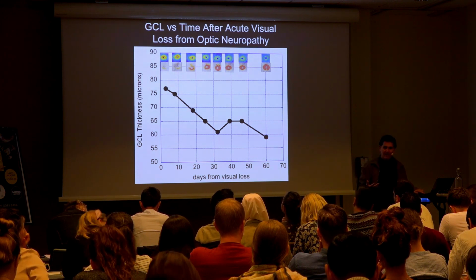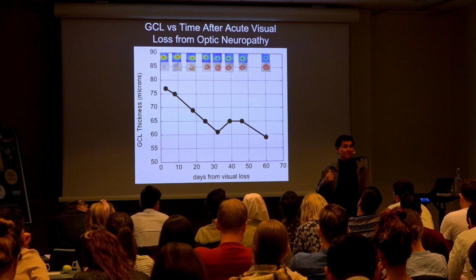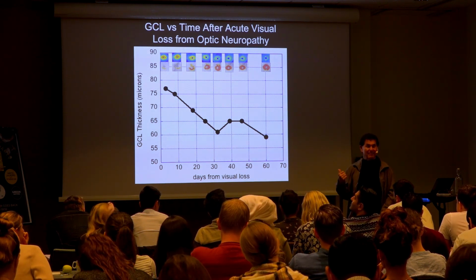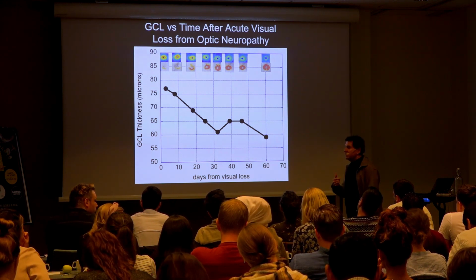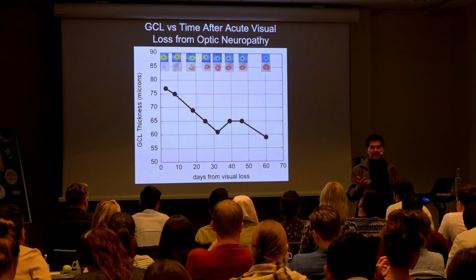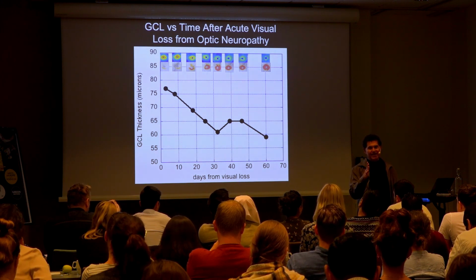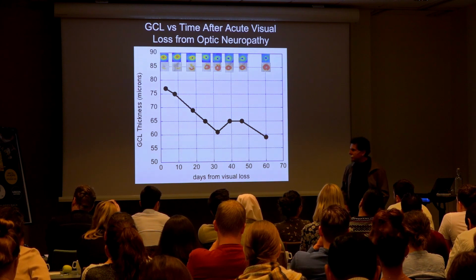And how does the optic disc look? Remember, there was some atrophy on the left eye, another sign that something had happened prior to what brought her to medical attention. Like you said, there's a possibility that she'd had it for many, many months and just hadn't noticed it. But when people start missing letters to the side, usually that brings it to attention pretty fast, in terms of that and getting the history.